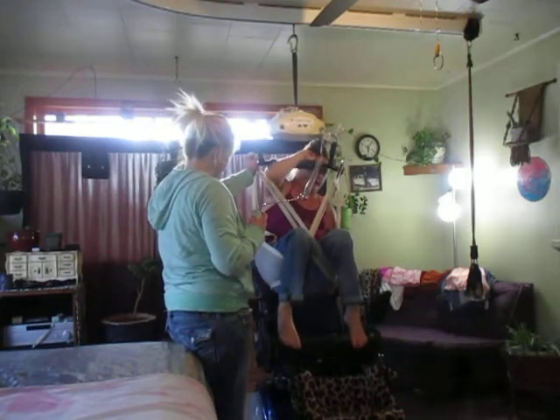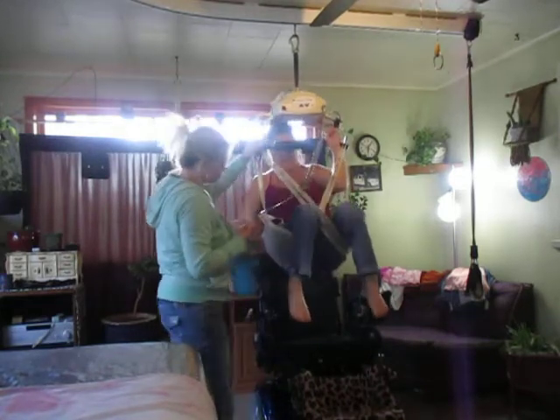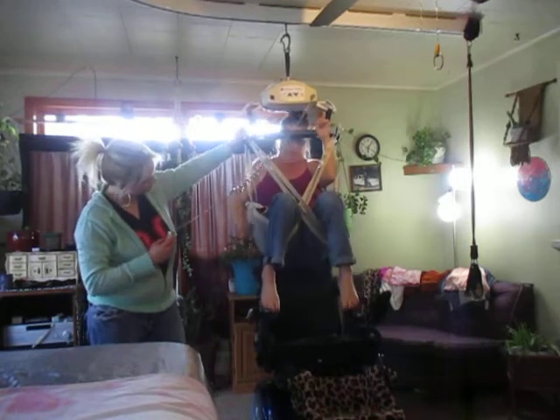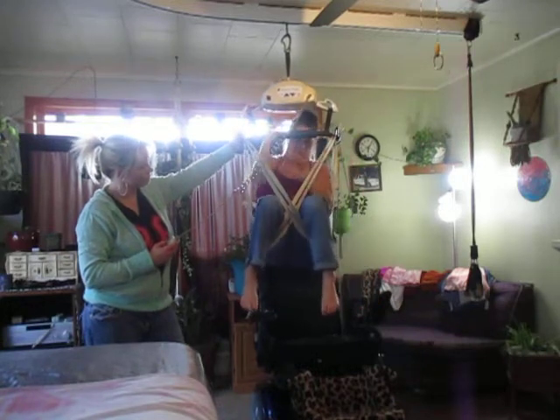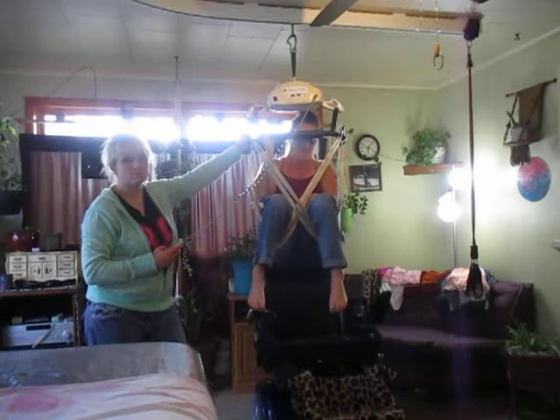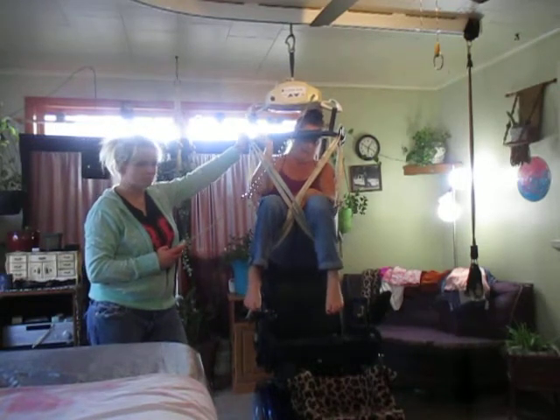You see how it comes to my butt bones on both sides? I think this one's a little bit off. It's got me because my butt bones are back here. If it gets done wrong, then I'm in a lot of pain. So I always tell the nurses, let me tell you where it's good so that it doesn't hurt — and then it's not them that hurt me, it's me that hurts me.